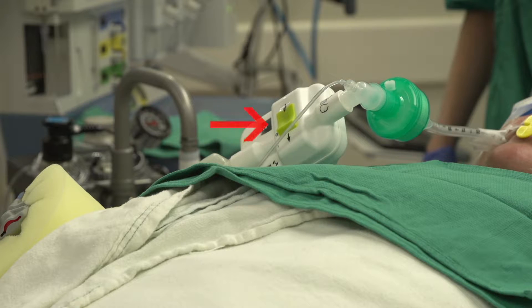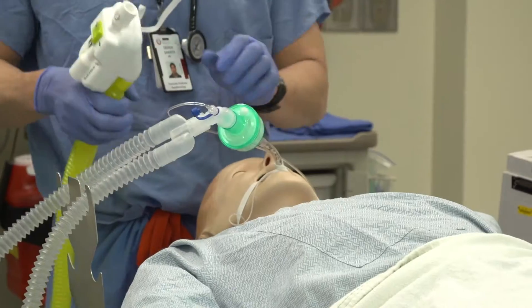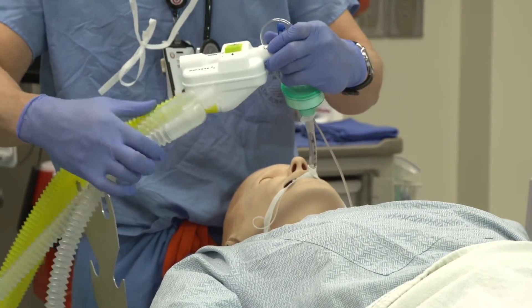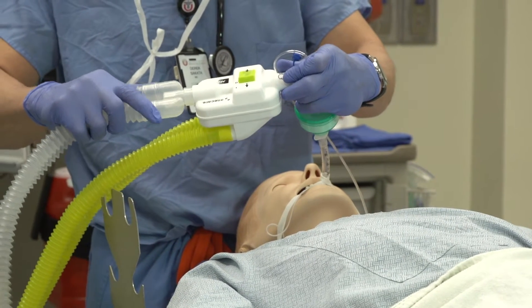AniClear is designed with an activation switch so that it can be inserted into the breathing circuit at any time prior to emerging the patient. When deactivated, AniClear is in bypass mode, adding only 8.5 milliliters of dead space into your breathing circuit. If applicable and desired, this bypass mode allows for AniClear insertion prior to surgical draping. Premature activation of AniClear during surgery may lead to emergence prior to surgical conclusion.